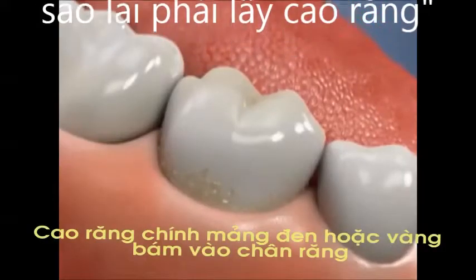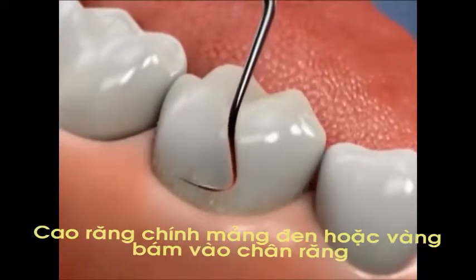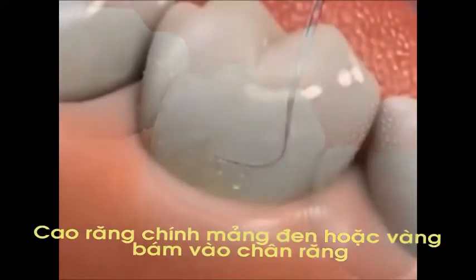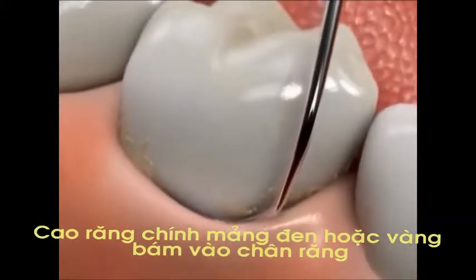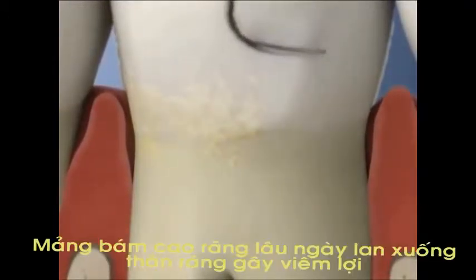If you have active periodontal disease, routine cleanings are not enough because they generally focus on the areas of the tooth that are above the gum line. A scaling and root planing procedure removes plaque, tartar, and bacterial toxins from the surfaces below the gum line. We carefully and meticulously remove the plaque and tartar, and then smooth the root surfaces.